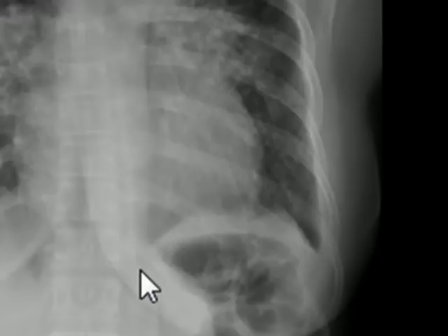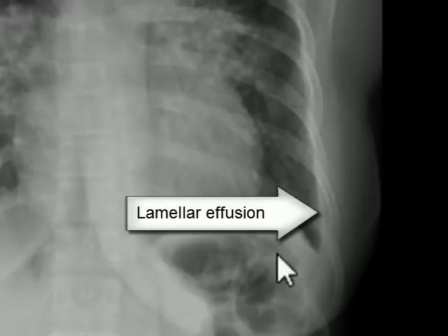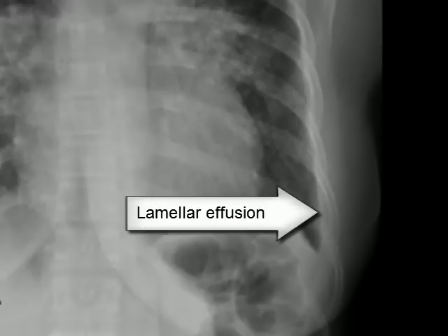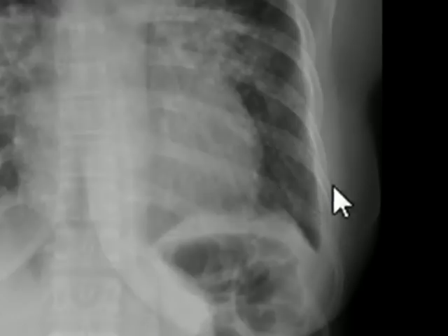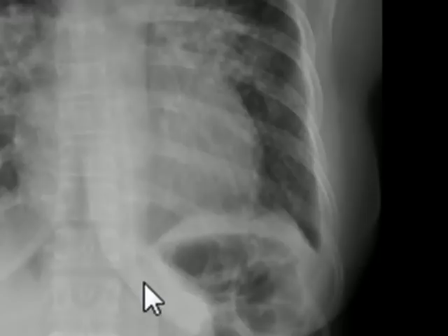Notice the gap between the chest wall and lung parenchyma. The density between the chest wall and lung parenchyma is running almost parallel to the chest wall. Also notice the absence of the classic meniscus sign, which would suggest a true pleural effusion. This is a classic sign of lamellar effusion.